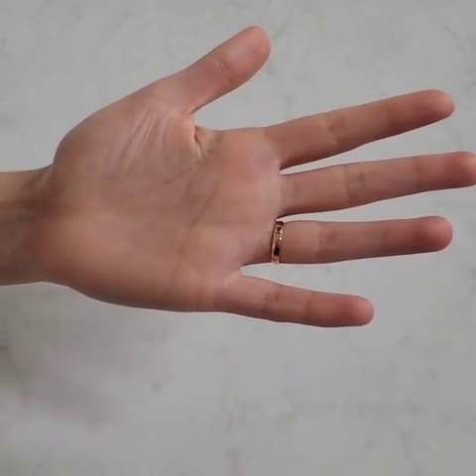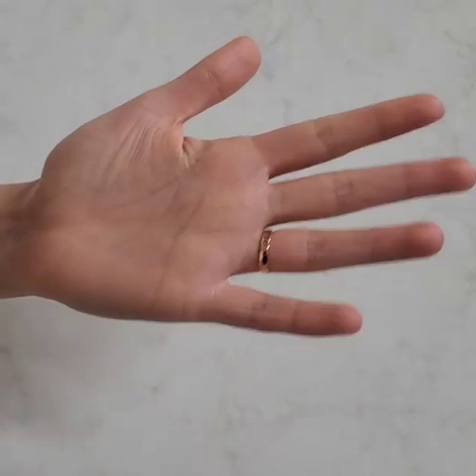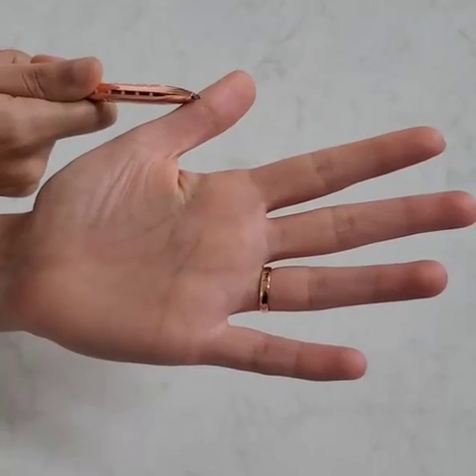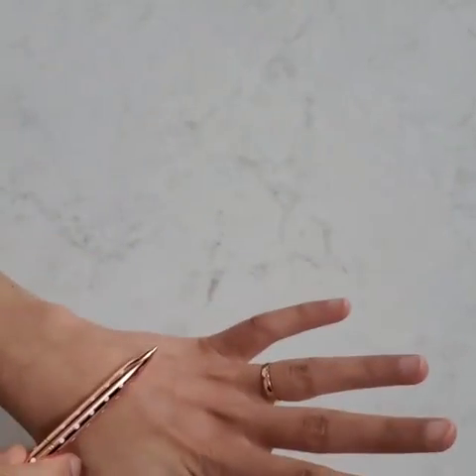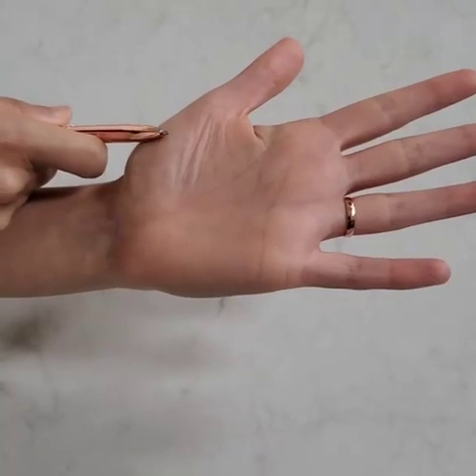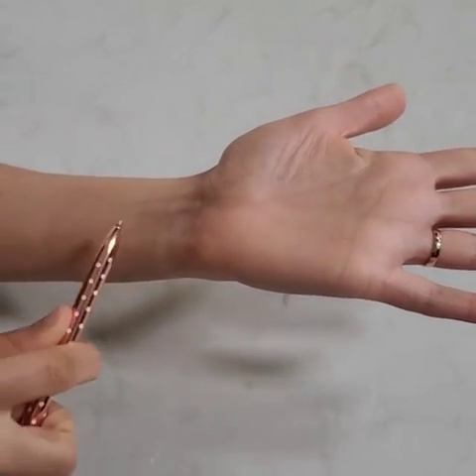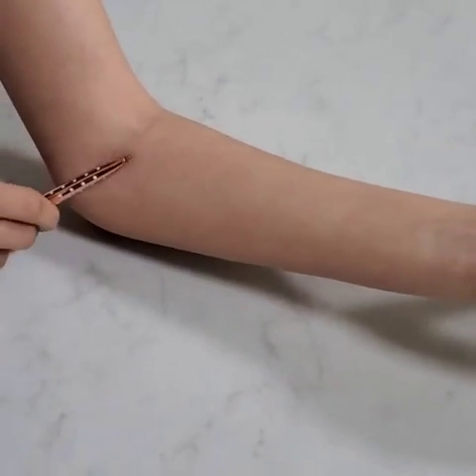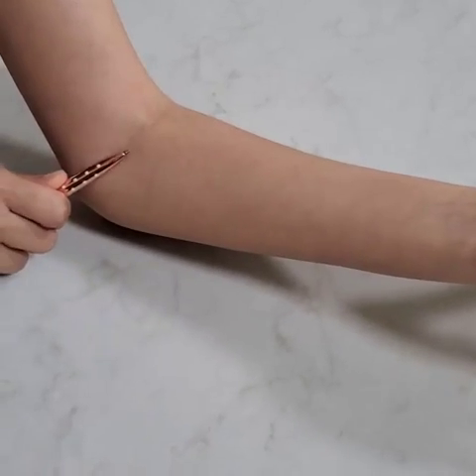Last week we reviewed the median motor nerve conduction study setup. Quick review: your active is over the abductor pollicis brevis, reference is four centimeters away at our bony landmark, and ground is on the back of the hand. You measure eight centimeters along the course of the median nerve. Your first stimulation site is here, and the second stimulation site is in the fossa, just medial to the biceps tendon.